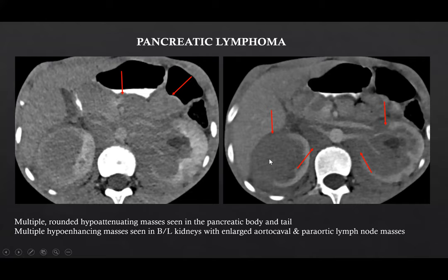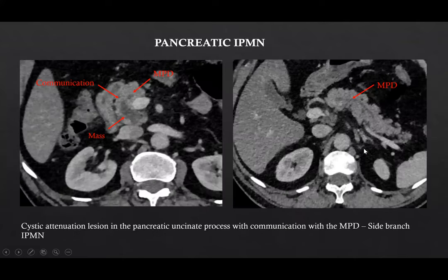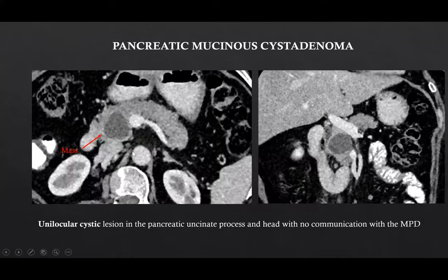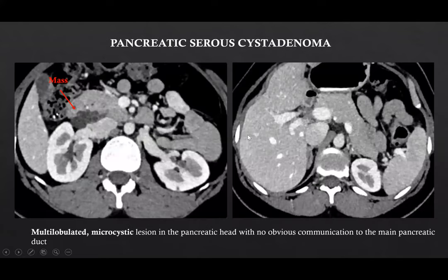Bilateral kidneys show evidence of multiple hypoenhancing masses with enlarged aortocaval and paraaortic lymph node masses. This was a case of pancreatic IPMN, where we can see a cystic attenuation lesion in the pancreatic uncinate process which is communicating with the main pancreatic duct, suggestive of a side branch IPMN. This was a case of pancreatic mucinous cystadenoma where we can see a unilocular cystic lesion in the pancreatic uncinate process and head region with no communication with the MPD. This was a case of pancreatic serous cystadenoma where we can see a multilobulated microcystic lesion in the pancreatic head with no obvious communication to the main pancreatic duct.